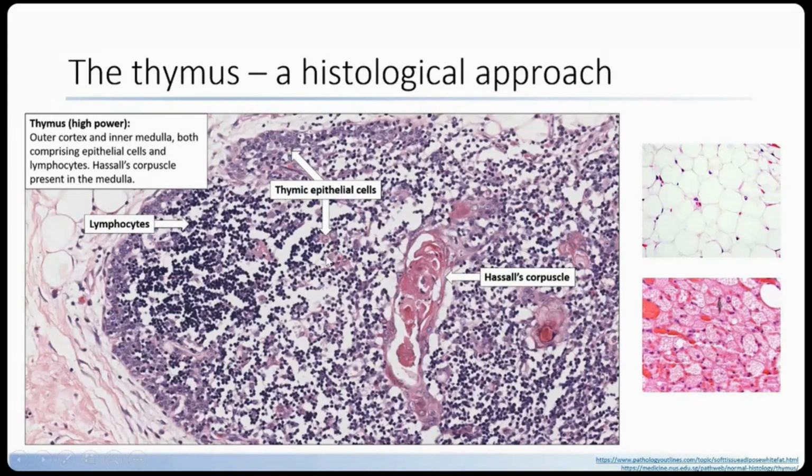As you can see here, hopefully at this magnification, they've got a fairly open chromatin pattern. They can have quite conspicuous nucleoli, and they've got a moderate amount of cytoplasm. It's really important in normal thymus to get your eye in for spotting these, because that can then become really helpful in terms of neoplastic lesions further down the line. So that's where we're at.